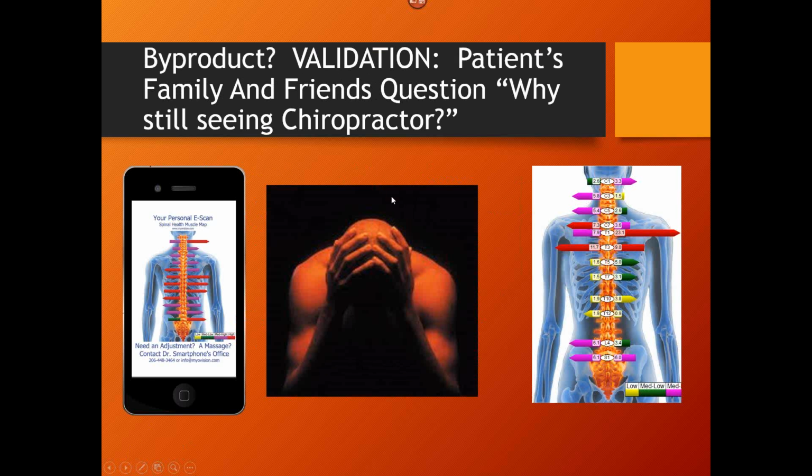One of the coolest things about this, and you know, when I invented the eScan, where you send the test to the patient via their smartphone, one of the coolest things that happened was listening to patients and beta testing was amazing. The number of patients that said, number one, this is the coolest thing I've seen, and my chiropractor is cool, to the second thing being, now I can show my husband or wife or someone at home why I'm still seeing my chiropractor. This validation is just huge. It reduces stress for the patient.